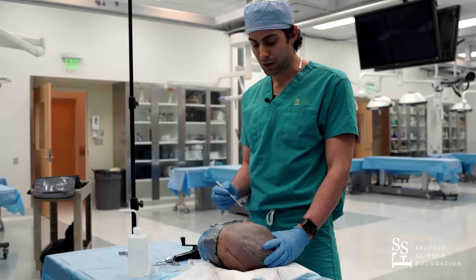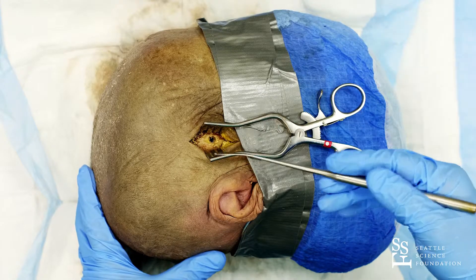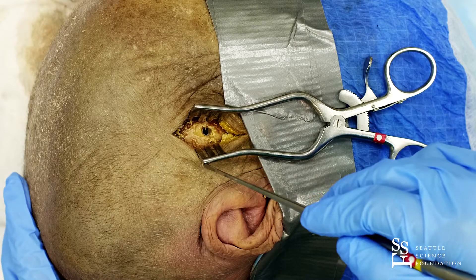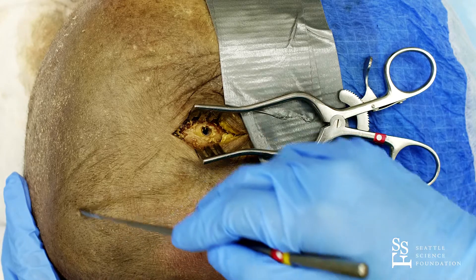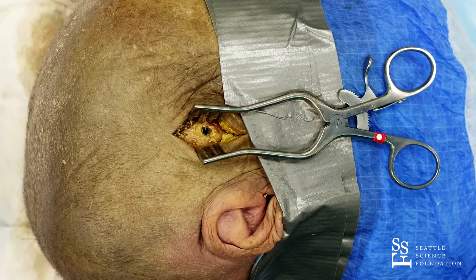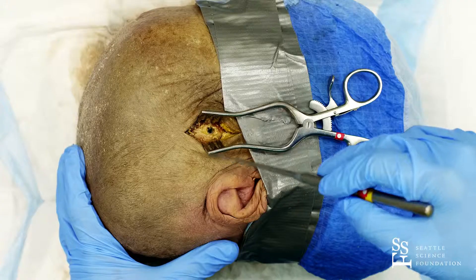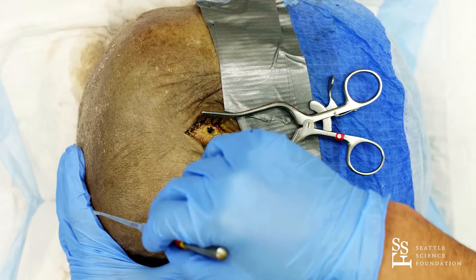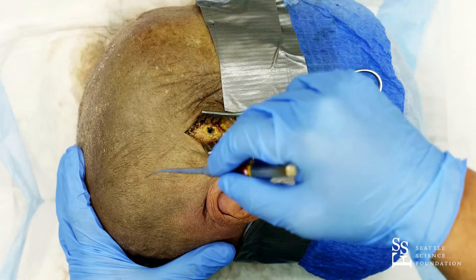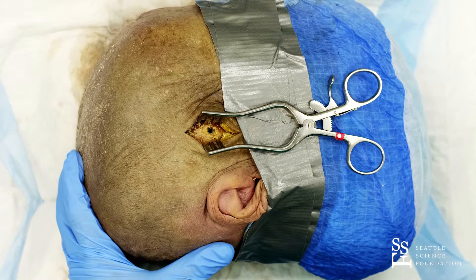Two important reasons for these locations: when the patient reaches the hospital and is taken to the OR, you will be able to connect all these burr holes to perform a more extensive craniotomy if needed. And they represent the most common bleeding sites inside the skull. That will be it — thank you very much.